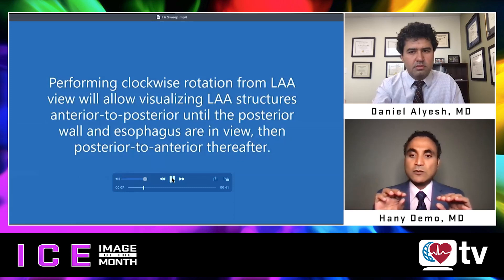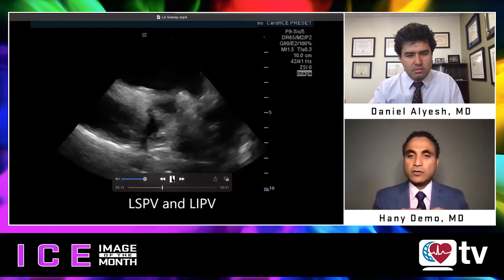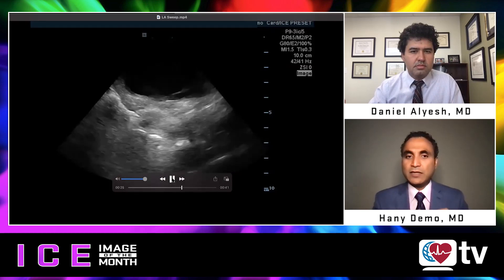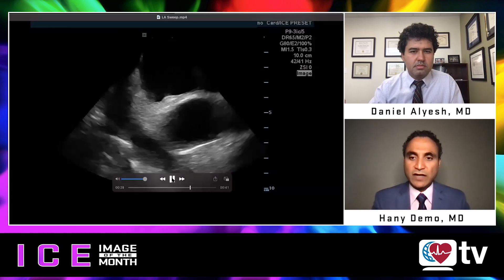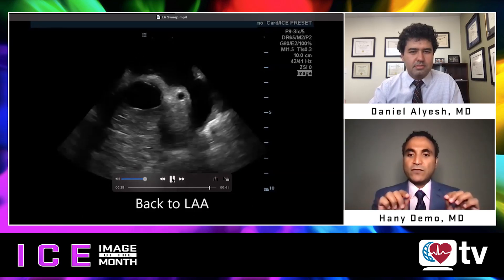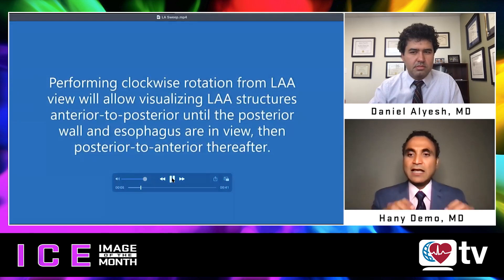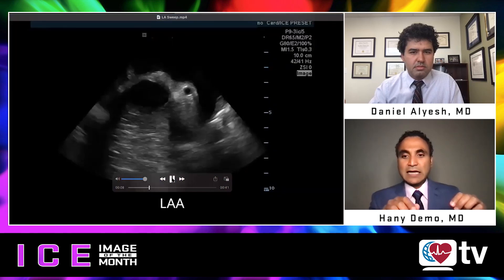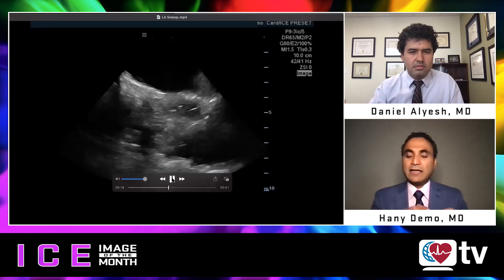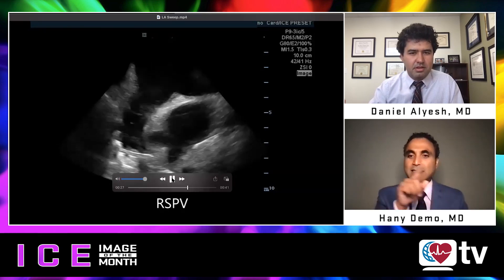Rotating slightly counter to 3 o'clock takes me to the left atrial appendage view. When I enter the left atrium, I start at 3 o'clock at the appendage to confirm there's no clot, and to understand the LAA anatomy relative to the left superior pulmonary vein. Continuing clockwise from 5 to 6 o'clock shows the posterior wall and esophagus. From 6 to 7 o'clock shows the right inferior pulmonary vein, and 7 to 8 o'clock shows the right superior pulmonary vein. Continuing to 12 o'clock shows the anterior wall and aortic knob — completing the 360-degree rotation.